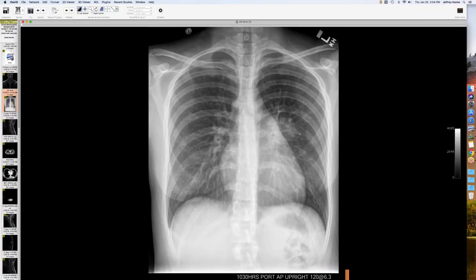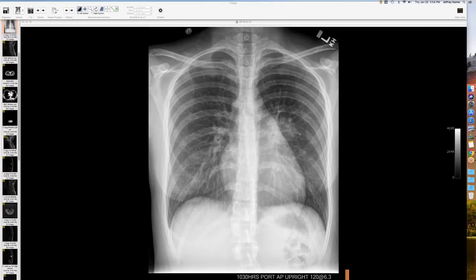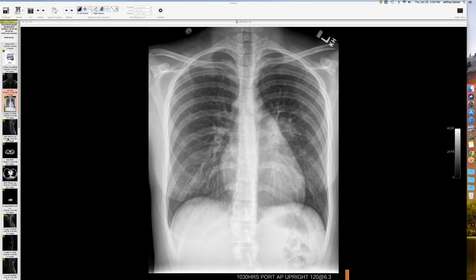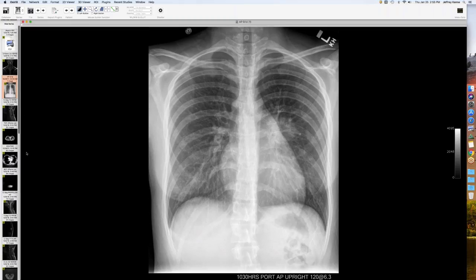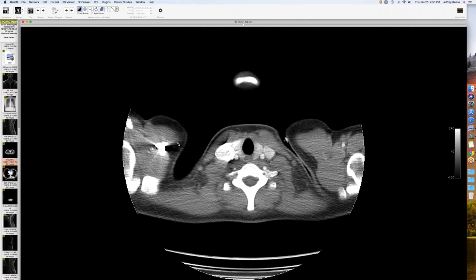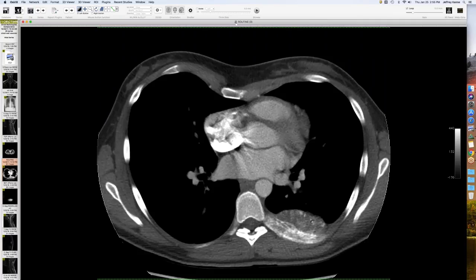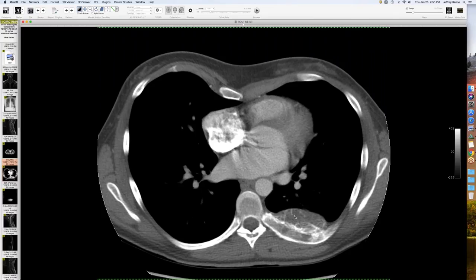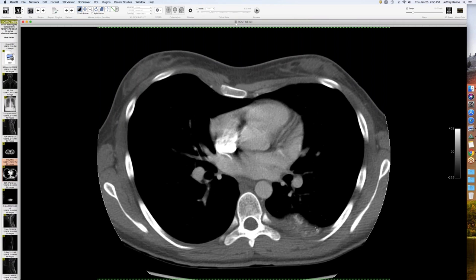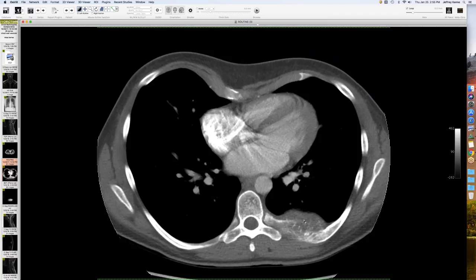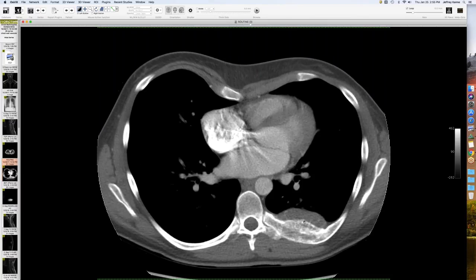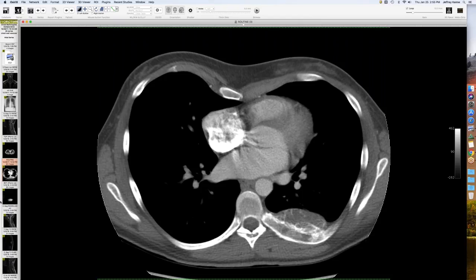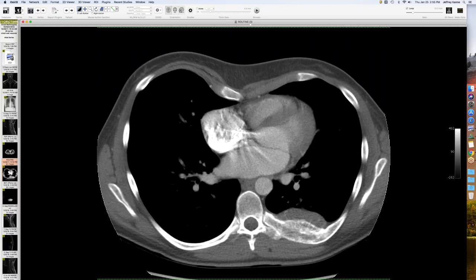An interesting case that caused great confusion. This is a 17-year-old who presented with a mass called a hilar mass, but there's actually a hilar overlay sign. CT shows this is not at a hilar location but associated with a rib — very interesting appearance with low-attenuation soft tissue, enhancement or bone or calcium, and periosteal reaction. Initial concern from MSK colleagues: this looked aggressive — Ewing sarcoma, osteosarcoma, or a telangiectatic type.